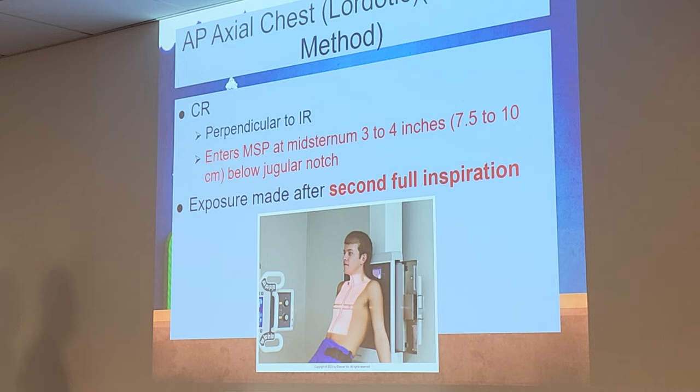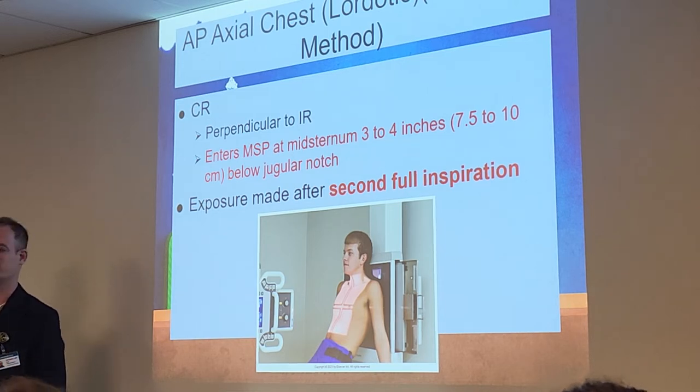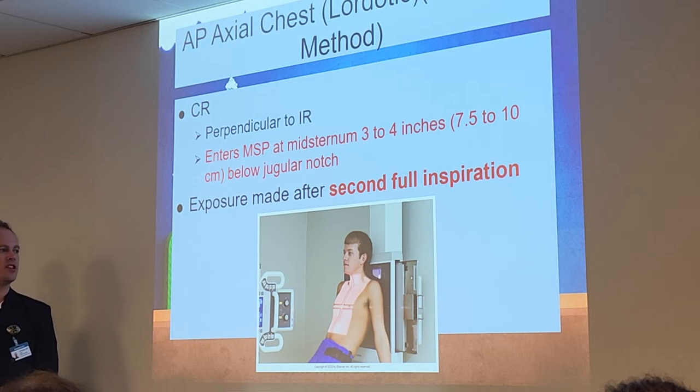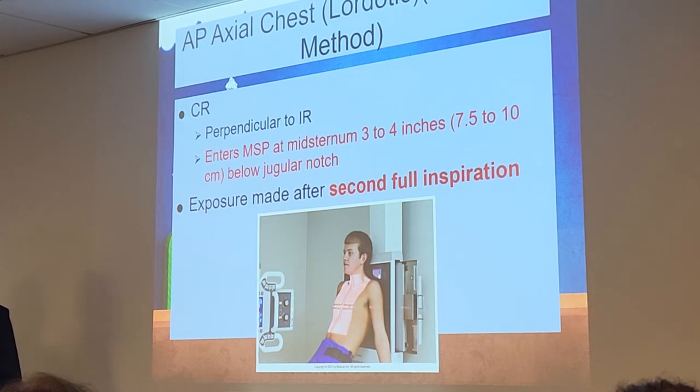Anybody see anything else wrong with that picture? Should his chin be tilted? The chin's up pretty good. Okay. We're only looking at the apices. The shoulders? Is it the SID?